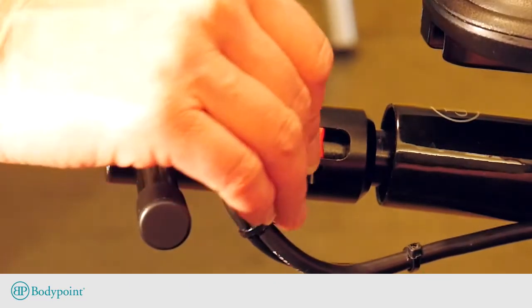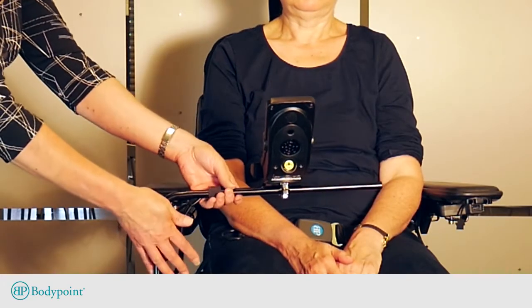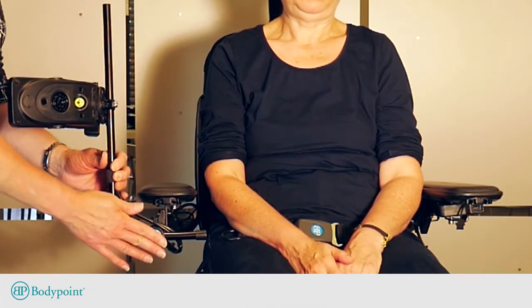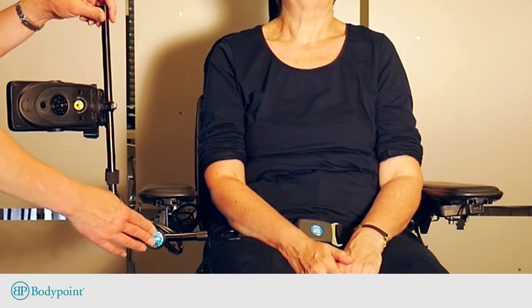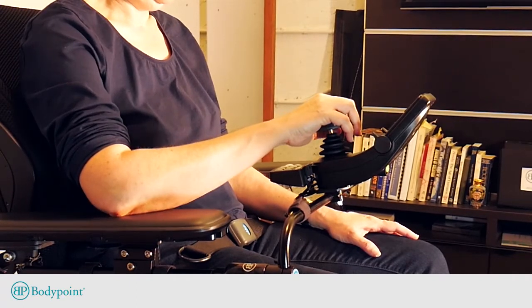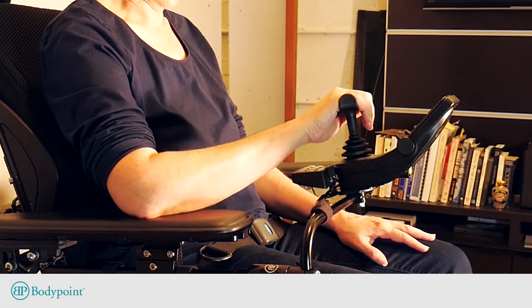With the straight end facing the screw, it is set for assisted release, which secures the joystick for bumpy rides or involuntary movements. A caregiver can push on the TriLock shaft to unlock it and rotate the joystick out of the way, or can toggle the flipstop to independent use. The TriLock combines durability and industry-leading versatility. Try one, perhaps, with a BP joystick handle and experience the difference.